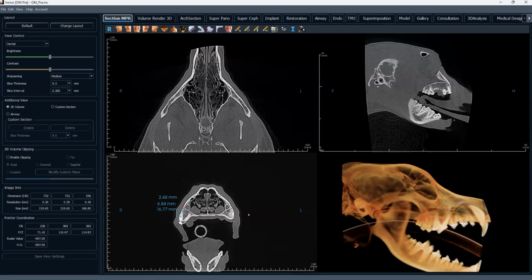And so that's why we use the gallery a lot, chairside, and you can just have one of your technicians or assistants tapping through these images to remind you of what these measurements are. So as we go back, we can make that measurement for each root along the way and map exactly where we want to place our buccal cut, how deep it needs to be.